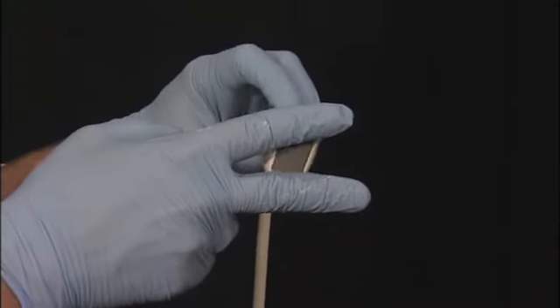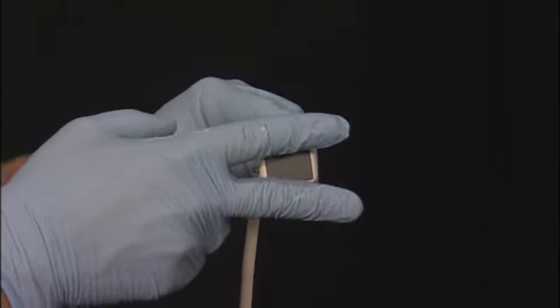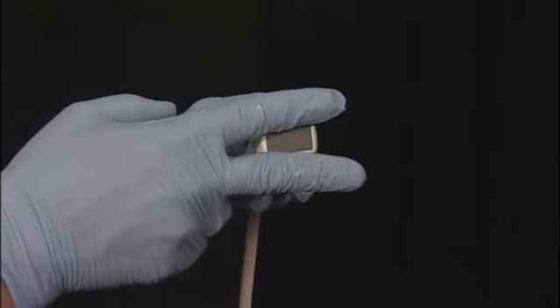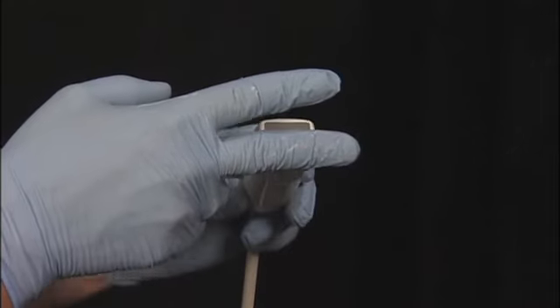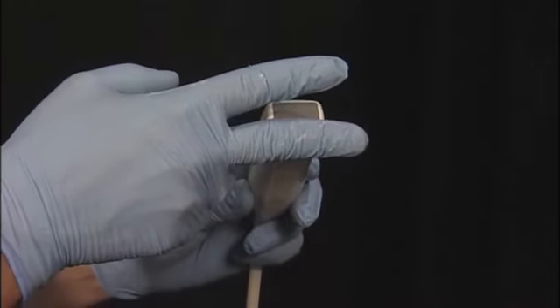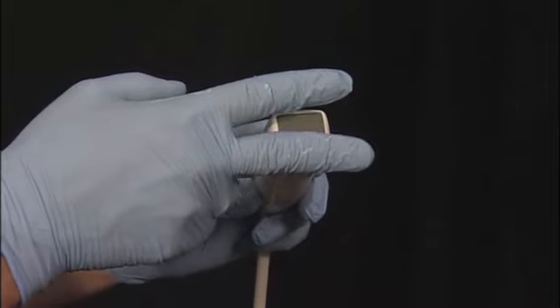The other thing that is important is that if you need to tilt the transducer, you will have the problem that you will obscure your view if you tilt it this way. So in this case, you'll have to move down a bit, move away from the ribs, and then you will get a good view within, or in between, the intercostal space.